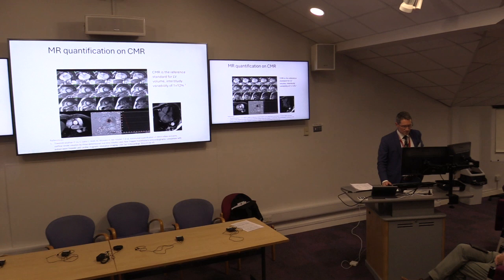We can also assess the amount of blood exiting into the ascending aorta. So this is a flow map. So your stroke volume is effectively your area under the curve here. So this is flow in mils per second over time. This is something called a flow map.